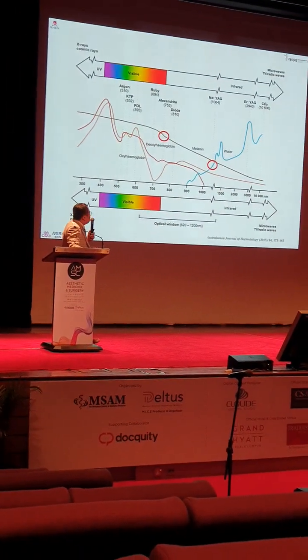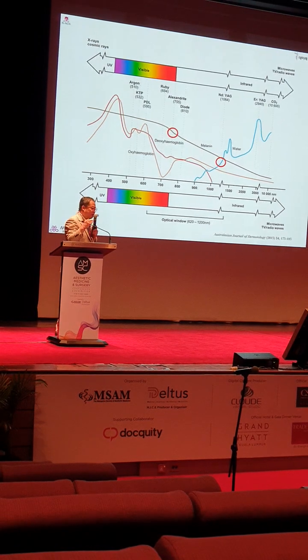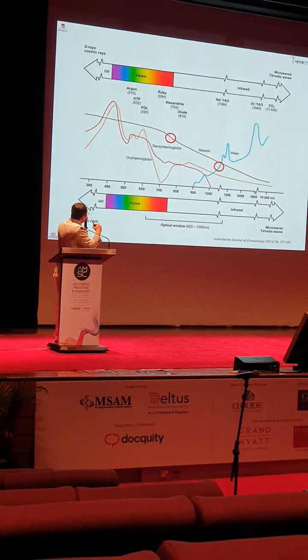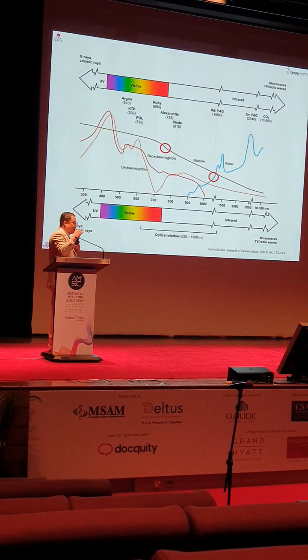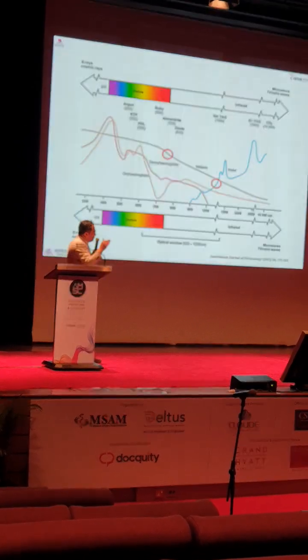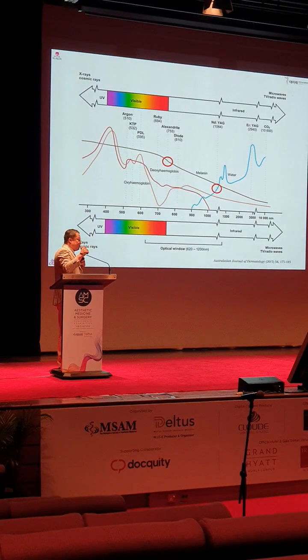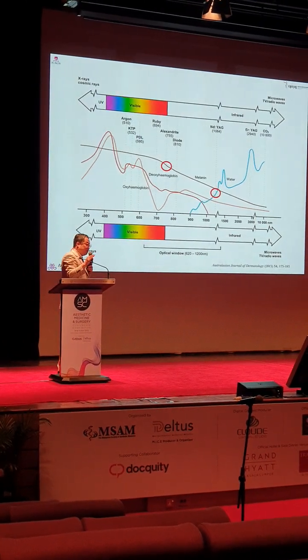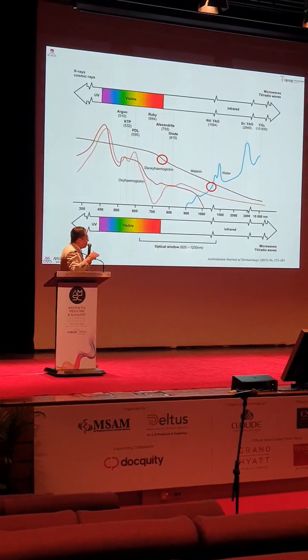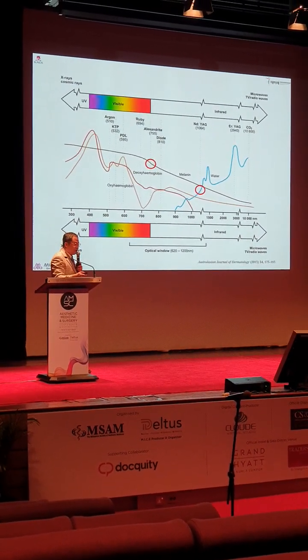So as we said, the triple wavelength diode laser affects different depths of the skin. As you can see, the Alexandrite laser has a high absorption coefficient for melanin, and melanin is probably placed near the basement membrane. So it will give thermal damage to maybe the upper dermis or the epidermis, and the Nd:YAG laser can penetrate deeper, and it could give thermal damage to the lower dermis or even the subcutaneous tissue.